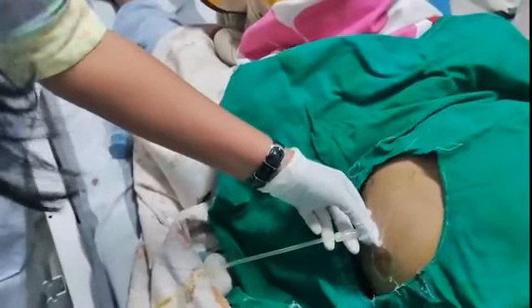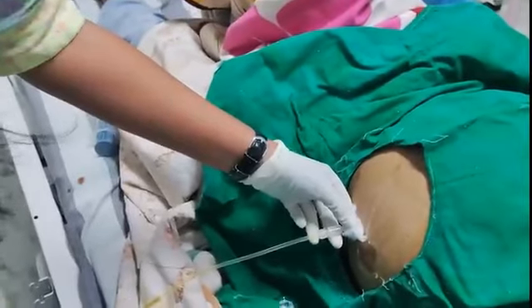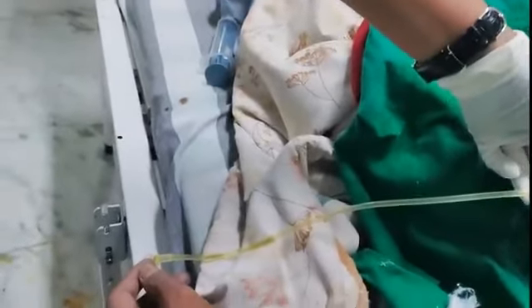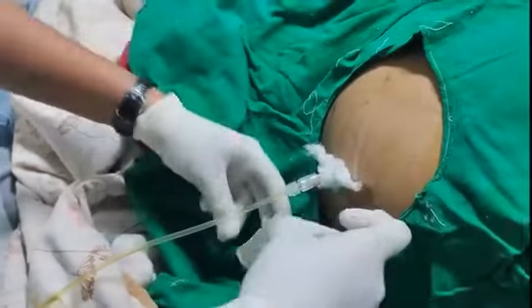Insert the needle through the peritoneum, generally accompanied by a popping sensation, and gently aspirate fluid. For diagnostic paracentesis, withdraw enough fluid, that is 30 to 50 milliliters, into the syringe and place the fluid in appropriate tubes and bottles for testing, including blood culture bottles.